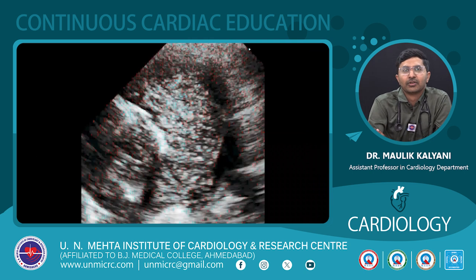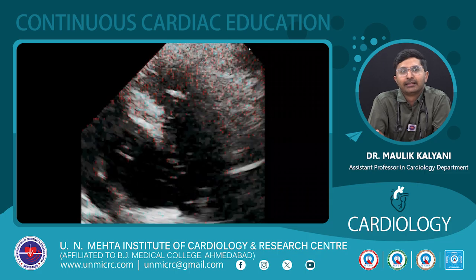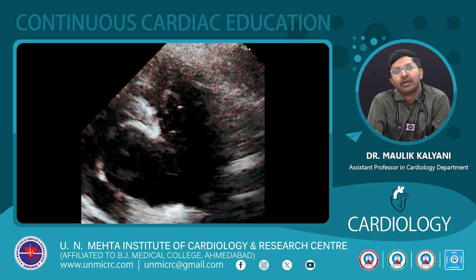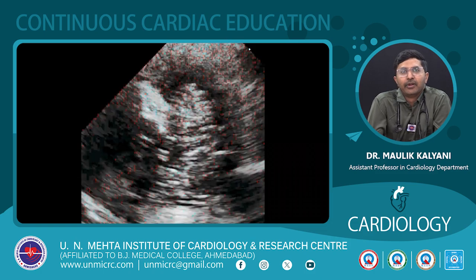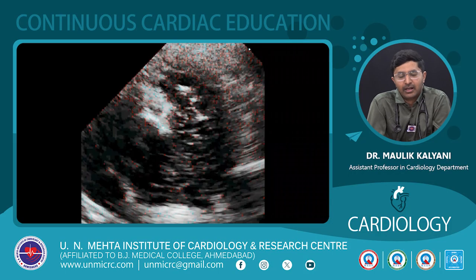The next image shows a short axis view showing the MPA and aorta, and on 2D there is no connection, there is no structure between the aorta and MPA. So there is a suspicion of an AP window, and when we inject the bubble contrast, it goes from the MPA directly into the aorta.